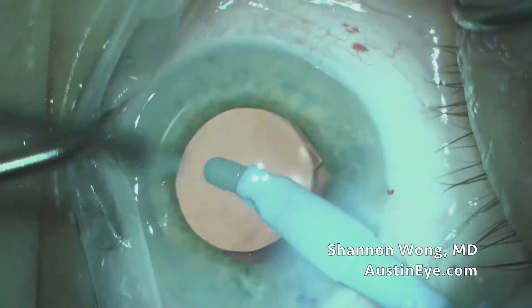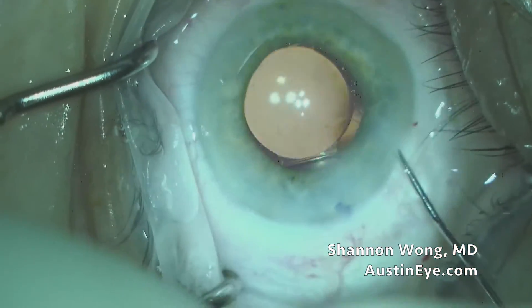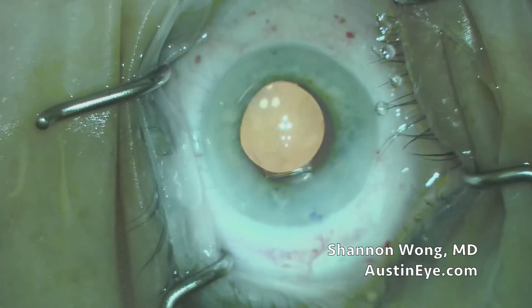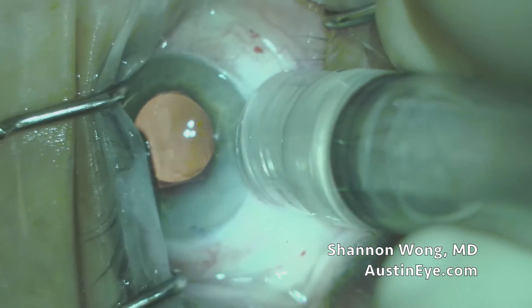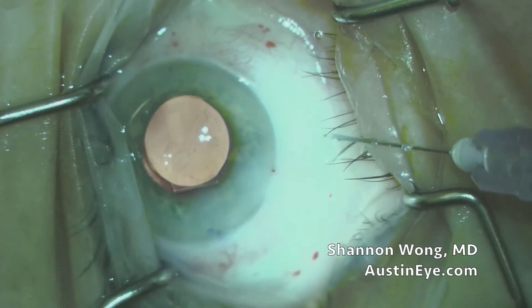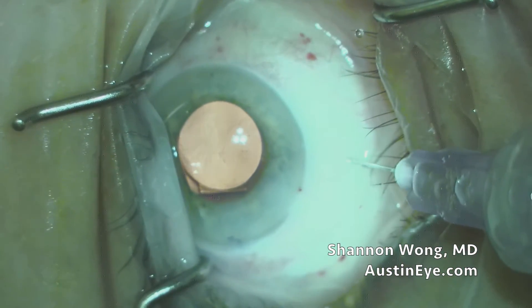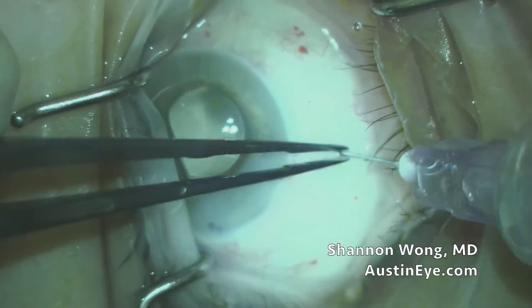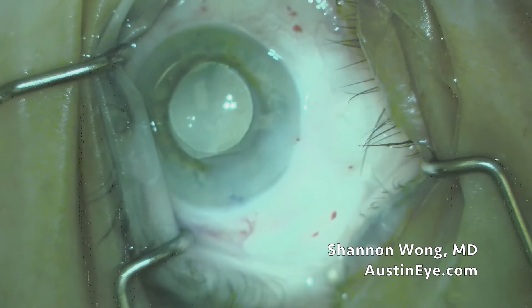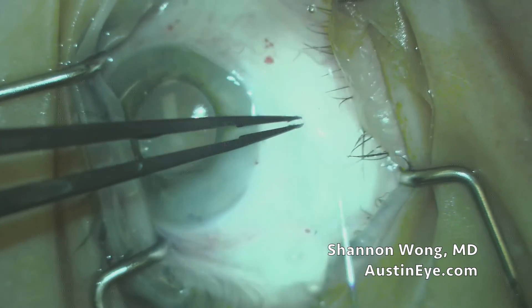We now know we're pretty much home free. We remove our viscoelastic in the usual manner, spin the lens around, and seal up our incisions. Then we go ahead and place our triamcinolone-moxifloxacin-vancomycin — aka TMV cocktail — through a pars plana injection, about 3 to 3.5 millimeters posterior to the limbus. We inject 0.15 ml of the TMV into the vitreous, and then 0.1 ml subconjunctivally.